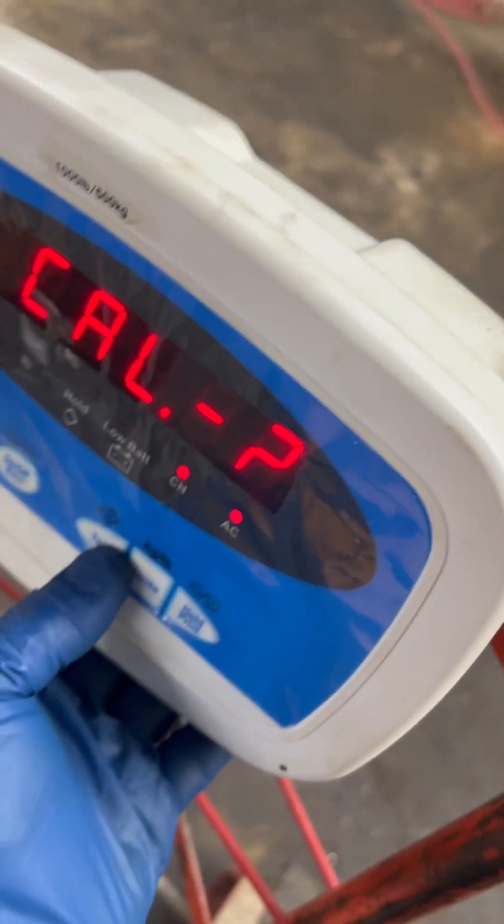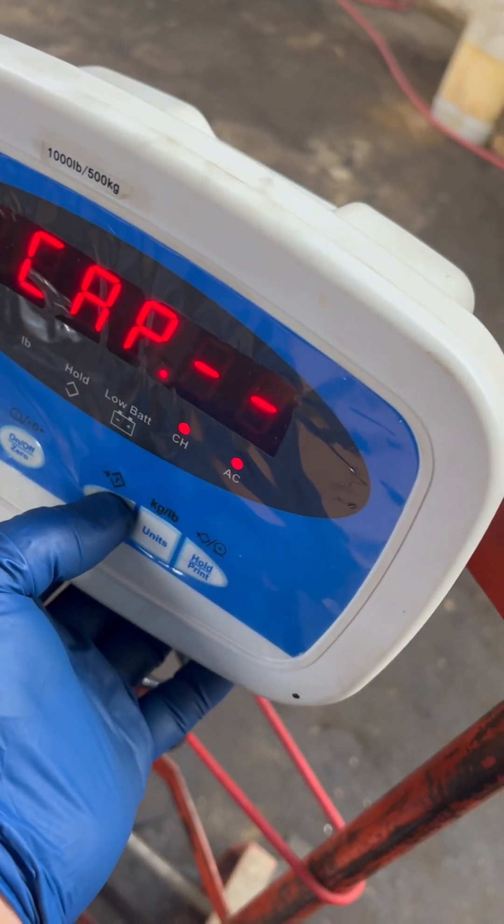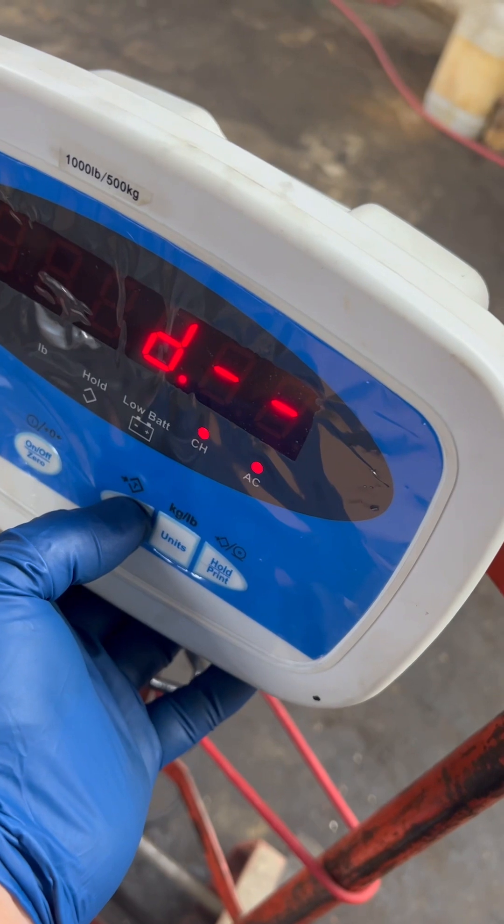At this point, you're going to press tare for the capacity. It shows you the divisions.